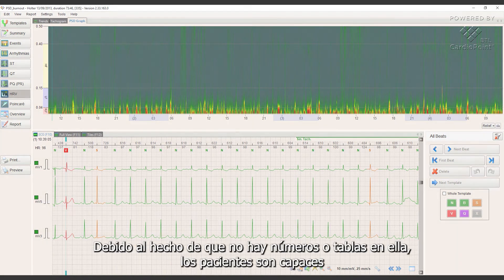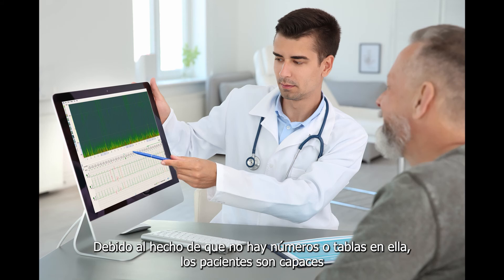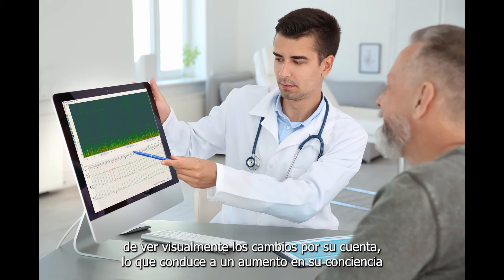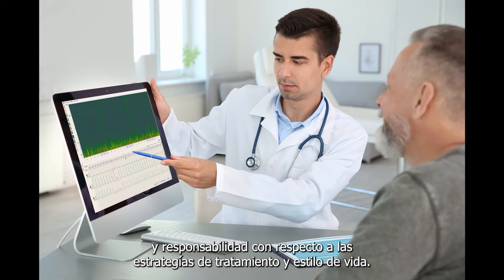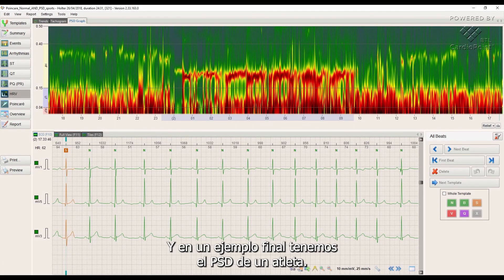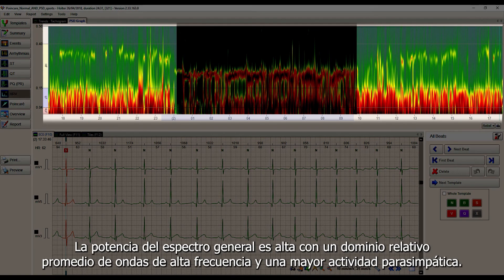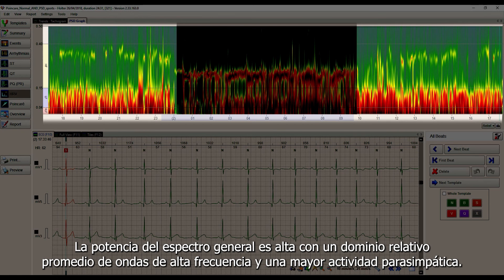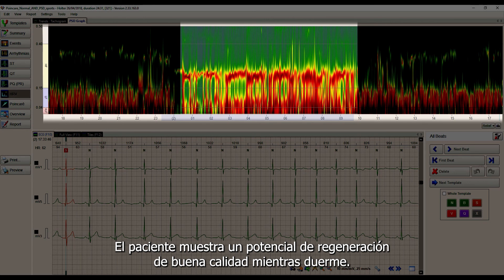PSD can be effectively used when communicating with patients. Due to the fact that there are no numbers or tables in it, patients are able to visually see changes on their own, which leads to an increase in their awareness and responsibility regarding treatment tactics and lifestyle. In a final example, we have an athlete's PSD — the overall spectrum power is high with average relative dominance of high frequency waves and higher parasympathetic activity. The patient shows good quality regeneration potential while sleeping.